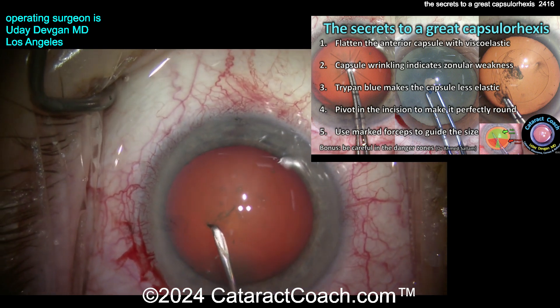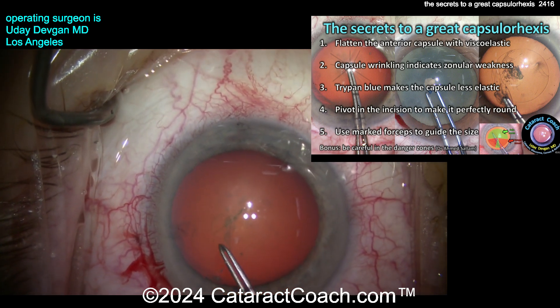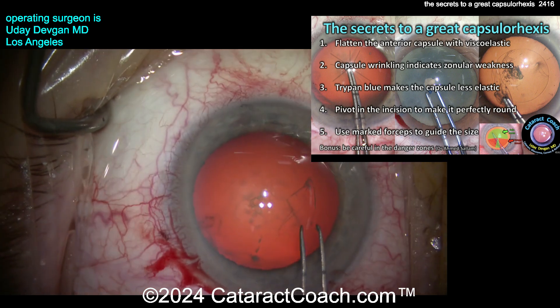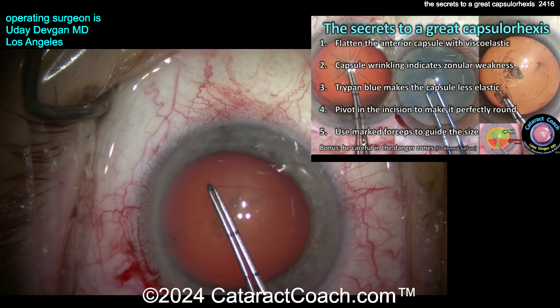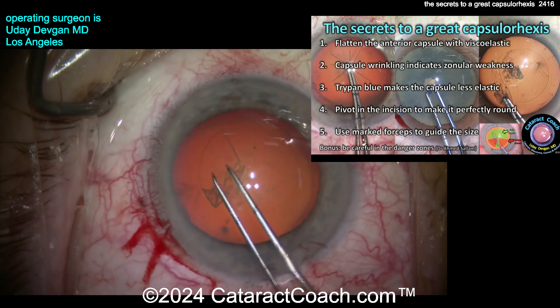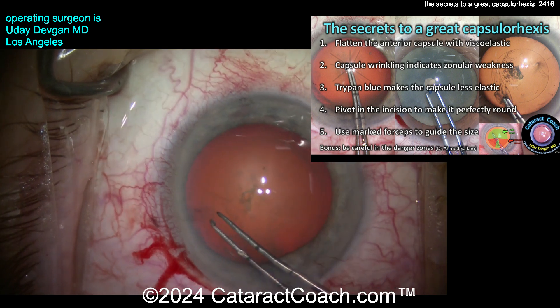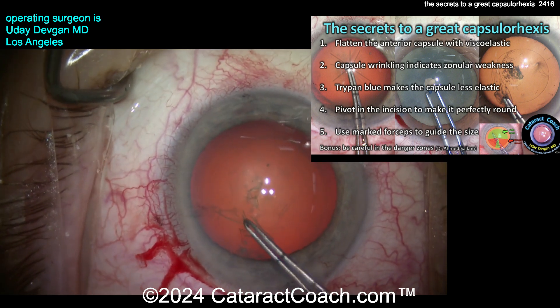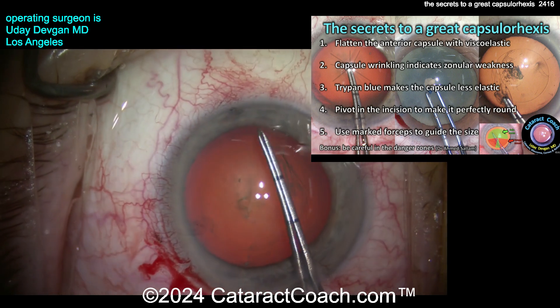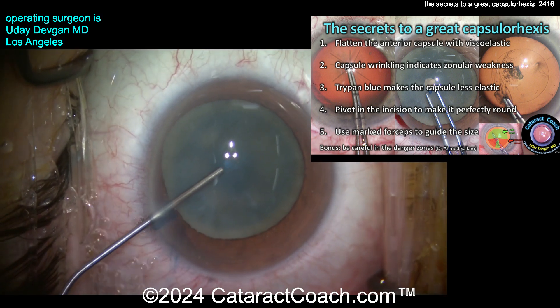So what does that mean? There's going to be some kind of global zonulopathy here. I'll go in with a sharp cystotome — and look, it works fine with a cystotome. So if I just used a cystotome, I would have had no idea that I have global zonulopathy and I'd lose zonules all around. In this patient I'm still able to get a beautiful five to five-and-a-half millimeter round centered capsulorrhexis, but I now know to be cautious — this is not really strong zonular support. If it was great zonular support, you'd have a nice strong taut lens capsule that's easier to puncture with forceps.